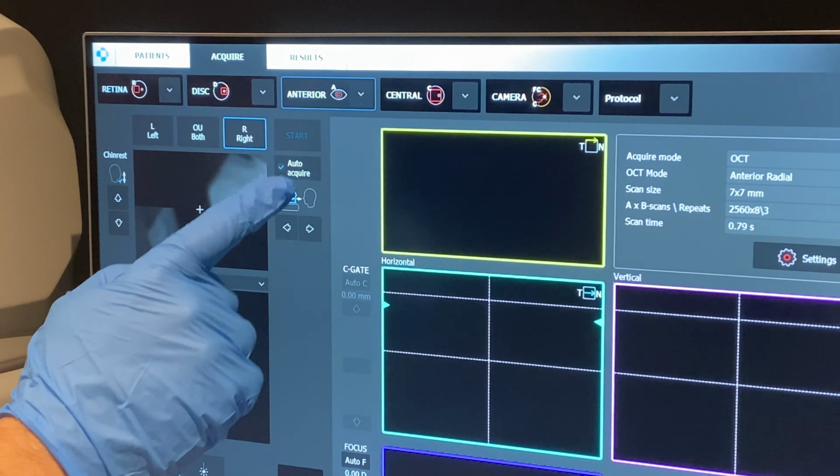And in both eye view, you also separately get ganglion cell layer analysis. So again, that's right eye, that's left eye. In single eye view, you don't see the ganglion cell layer analysis. So there's retinal thicknesses, normative database at the bottom. You have these sub windows as well. At the moment that's nerve fibre layer, ganglion cell and inner, but I can change that to, if I wanted to, ganglion cell layer and inner only. Or I can display retinal thickness, which is what this map is, so hence these values are exactly the same.